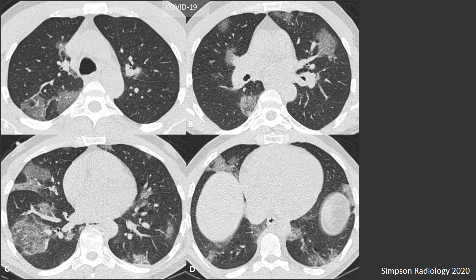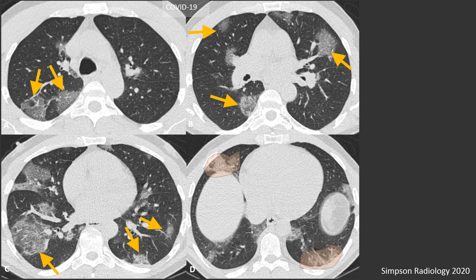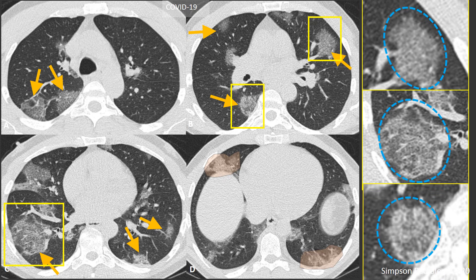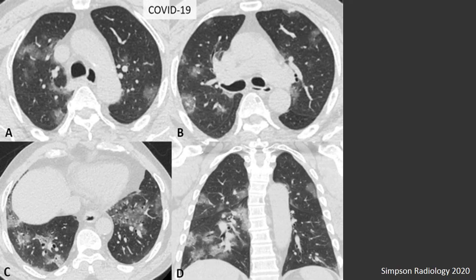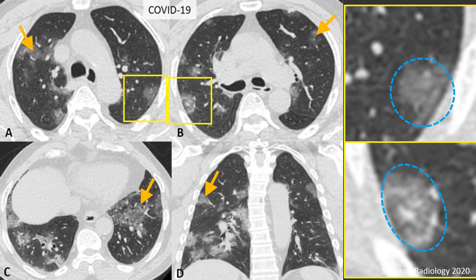Here's a CT of somebody with COVID-19 demonstrating typical features. We see multiple bilateral ground glass opacities, some of which are peripheral in location and when studied more closely demonstrate a rounded morphology as well as visible intralobular lines indicating crazy paving. Another person who tested positive shows multiple bilateral ground glass opacities, some of which appear rounded in morphology.